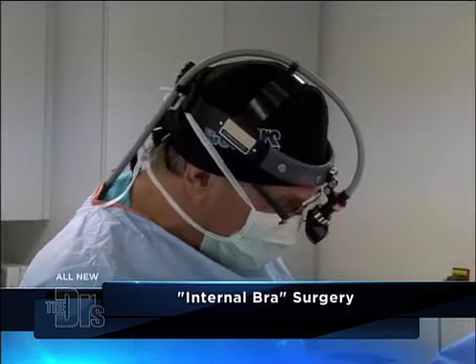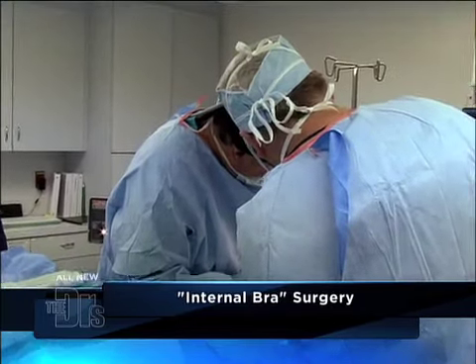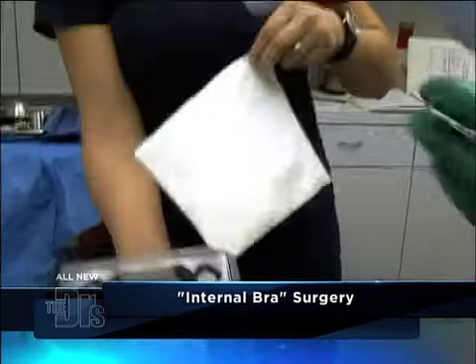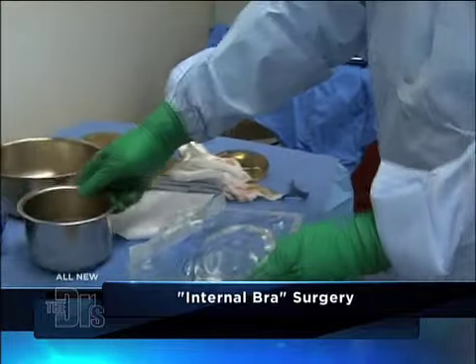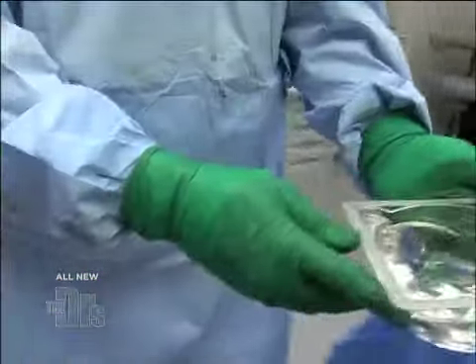So we're gonna move on now. We're gonna take out these sizers and put in the definitive 300cc high-profile Mentor implants — we love them, that's what we like to roll with. We're taking her from a deflated B to a nice medium C cup.